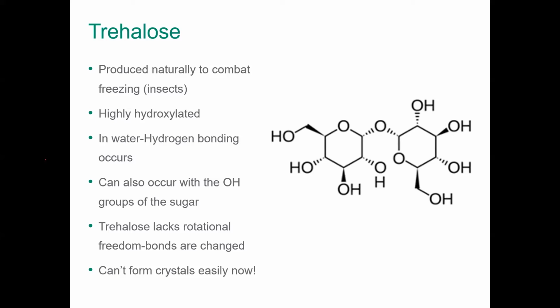So trehalose, again, stabilizes the membrane, and it also has poor solubility at low temperature. So it stabilizes the protein in the solution of the vitrification media. And it helps to reduce crystals, because it interacts with water more than other sugars.